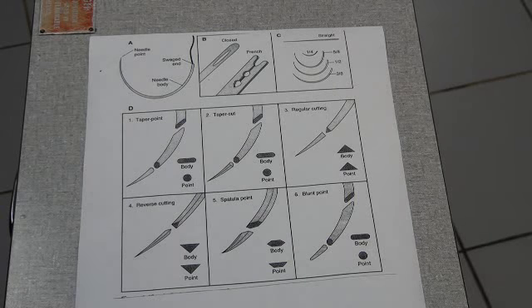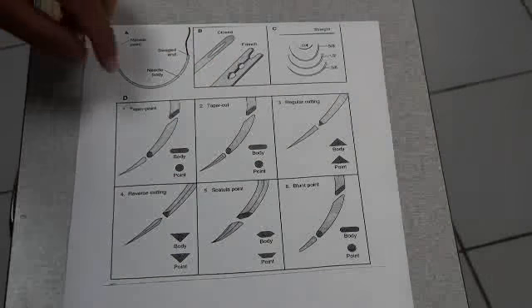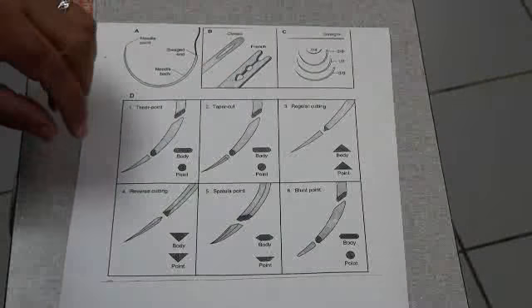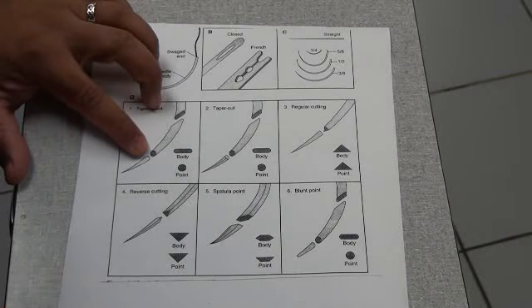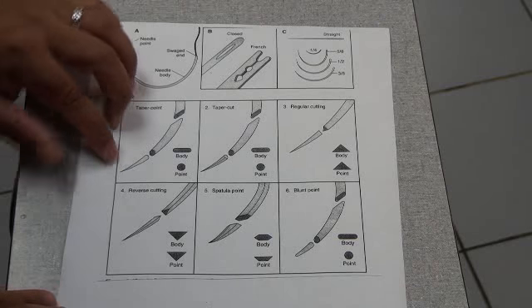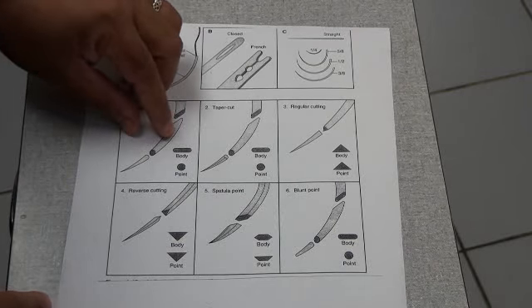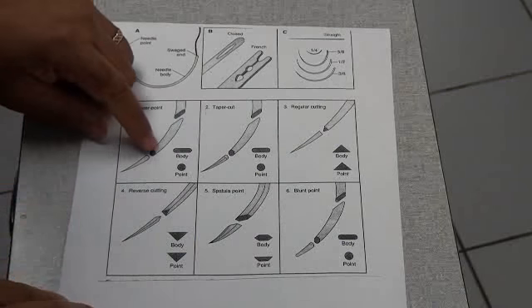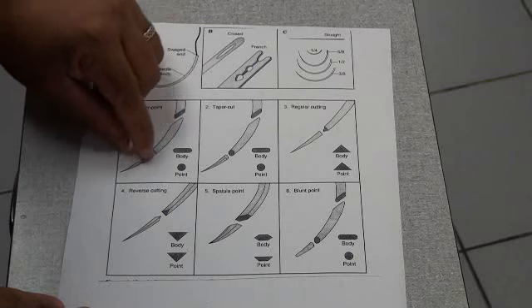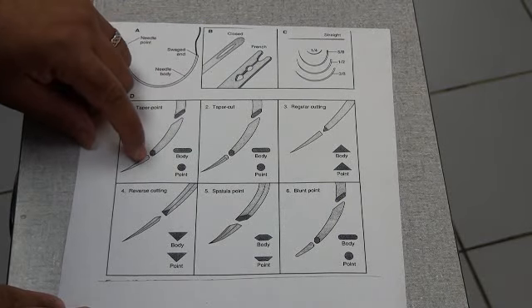For 9.1, the size and shape and uses of various suture needles. We have this little diagram here of different types of suture needles. We have first the taper point needle, which has a sharp point on it but a round body. Taper point needle has a round cross section. It can penetrate tissue easily without cutting the point of insertion at all.